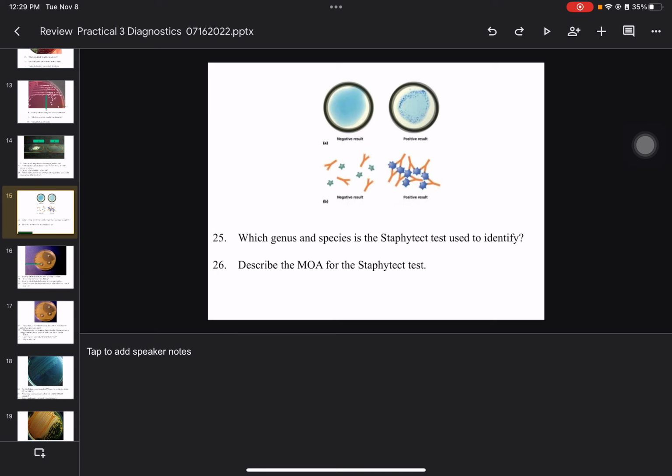Staph, and what is attaching to it is the antibody against it that's attached to latex. Wait, okay, it was the latex. Was it powdered or just the drop? Just the drop, right? So the reagent is a liquid, but the antibody that's bound to the actual latex. Latex is plastic, or a type of plastic. So the reagent is latex?